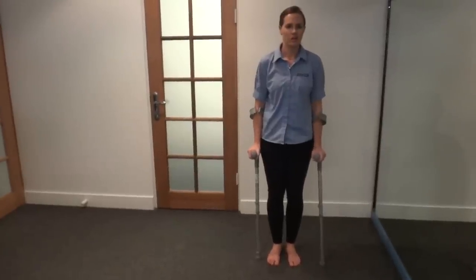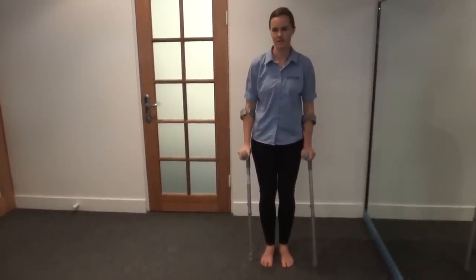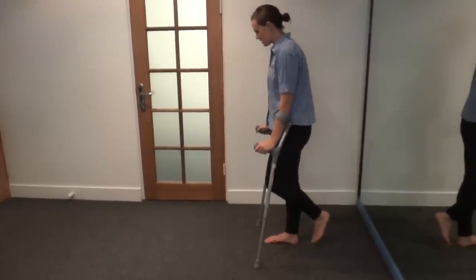I'm going to demonstrate how to use crutches when you have a non-weight bearing foot on even ground. My left hand side is going to be my non-weight bearing foot.